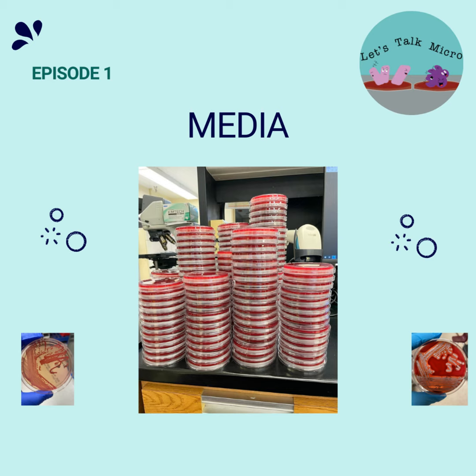aerogenes. So I'm like, what? Like, Pasteurella aerogenes. I was a little surprised. Pasteurella not growing on Mac. So here is where I go to another great resource that has no affiliation to this podcast. I go to an ASM book, American Society for Microbiology. They actually establish the procedures on how to, what media we use, how to properly work up the cultures, basically what we need to rule out on a particular source.